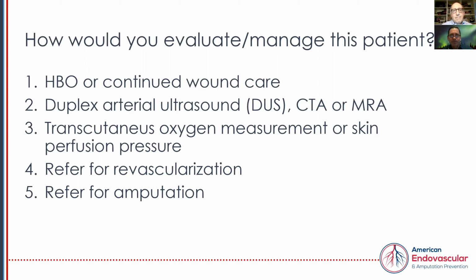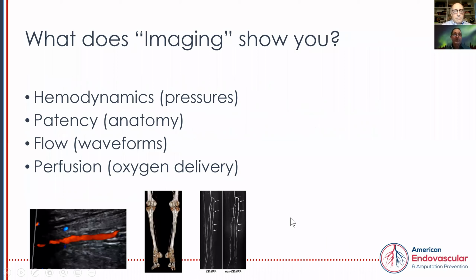And nobody said just continued wound care. So I think everyone on this chat at least feels like some sort of additional evaluation is necessary. So let's jump into this, because obviously this is the crux of today. We're talking about CLI imaging. So what does imaging show you?